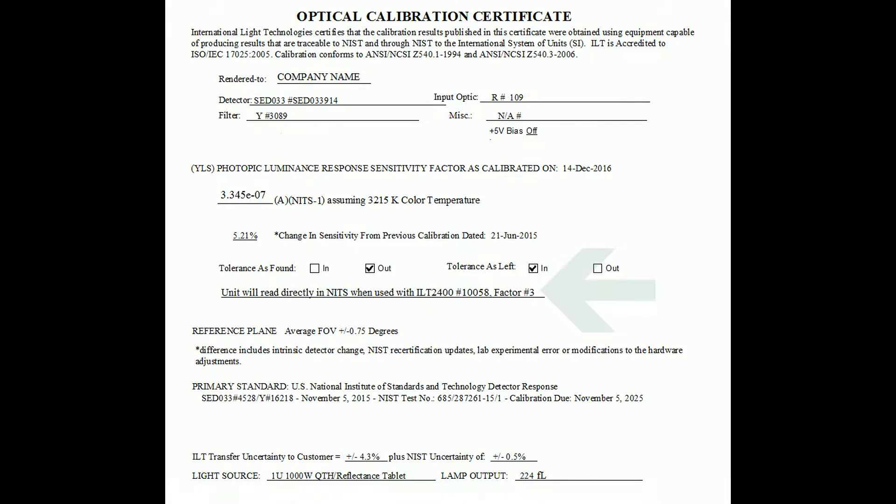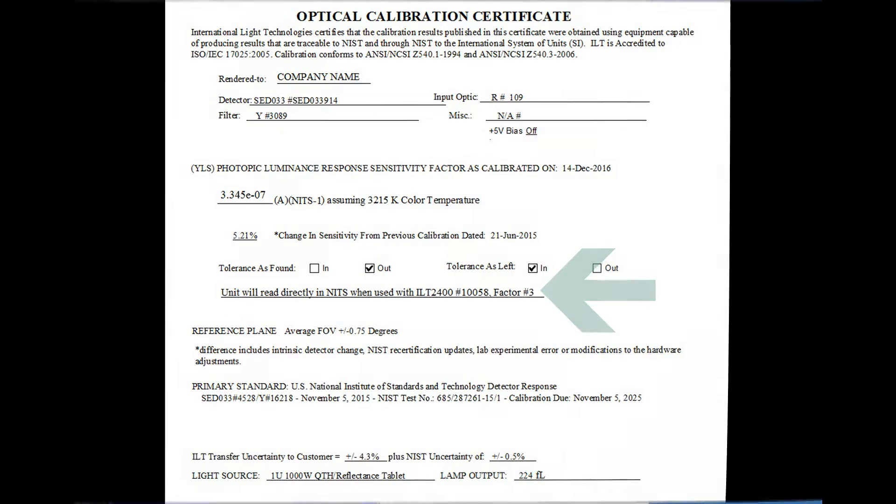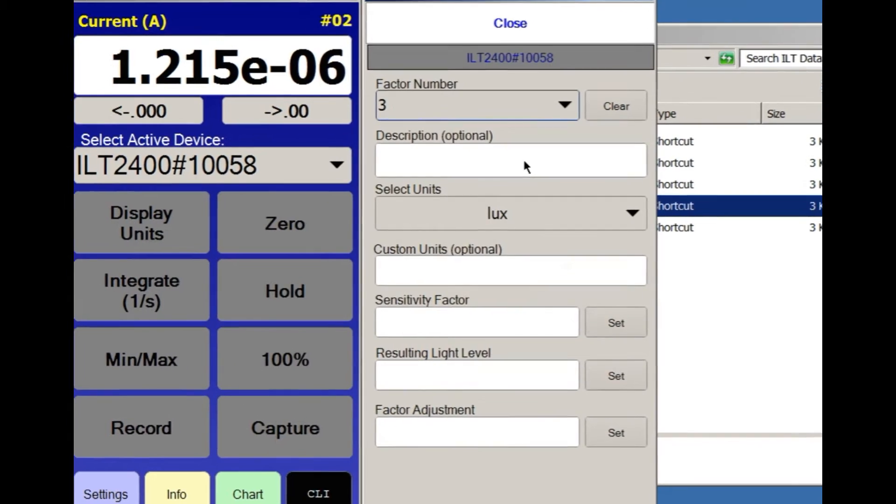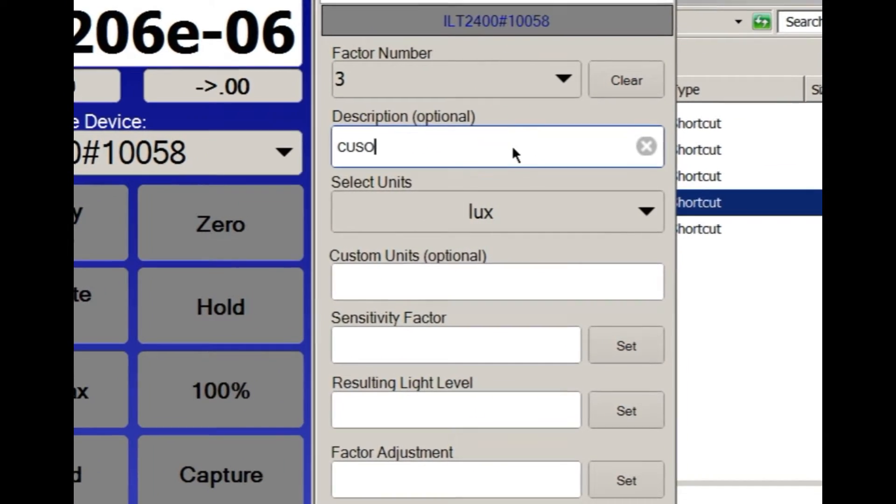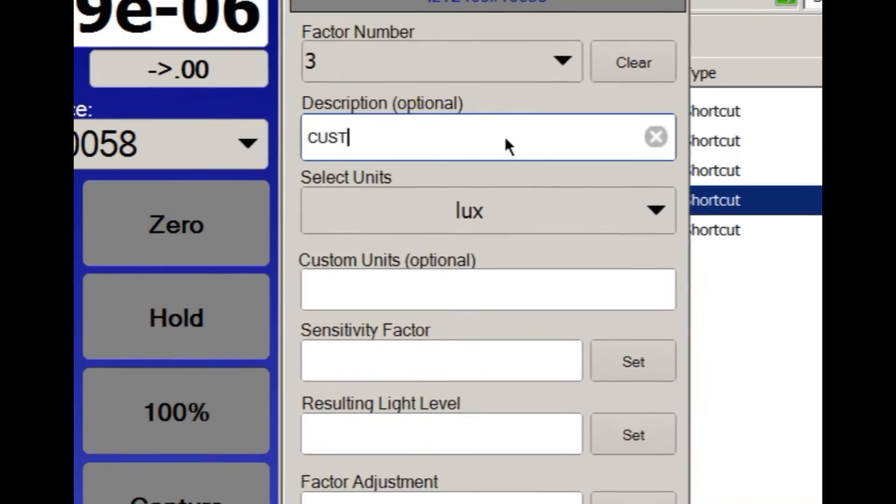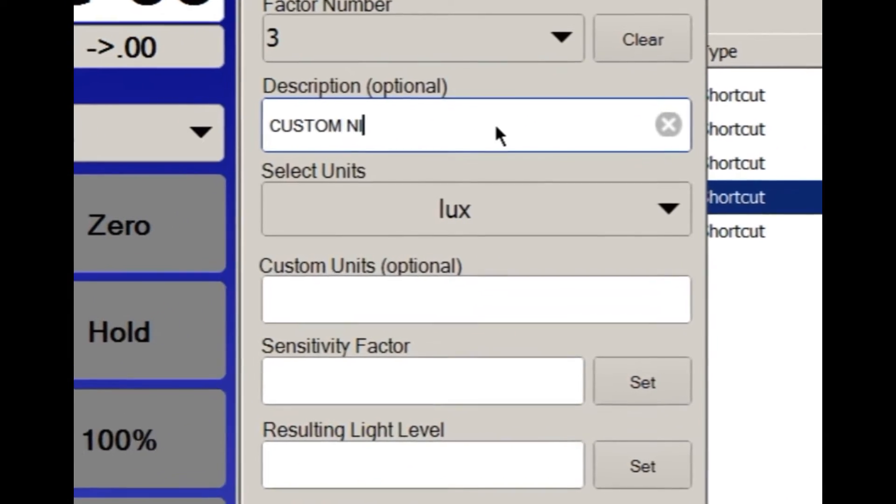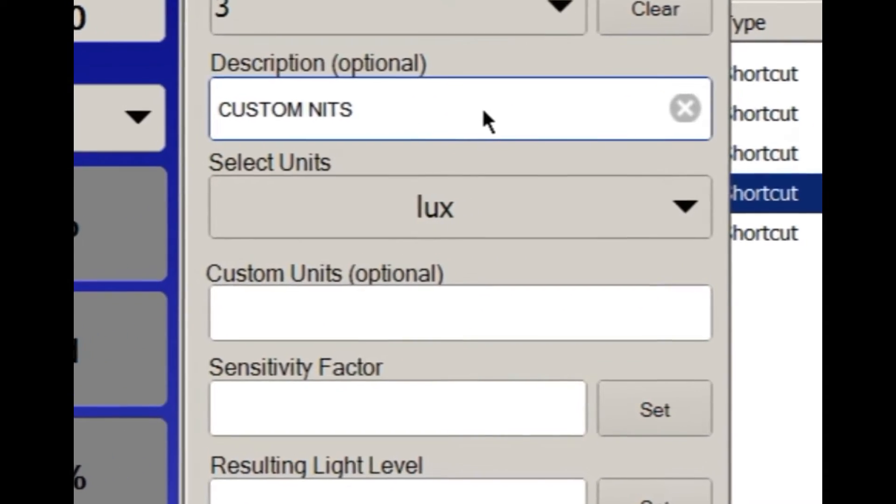The certificate should also state the units for readout. In our example, we use NITS. Enter in a description to help identify your new calibration factor.